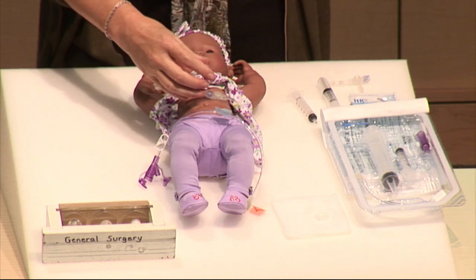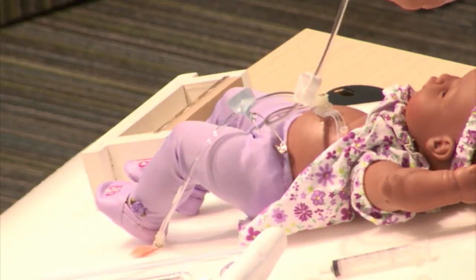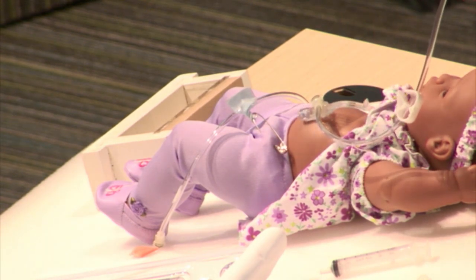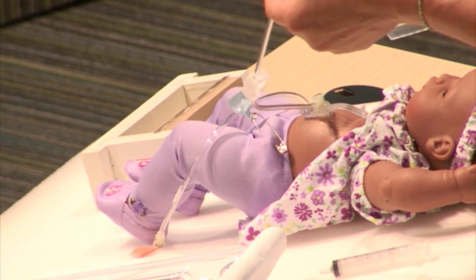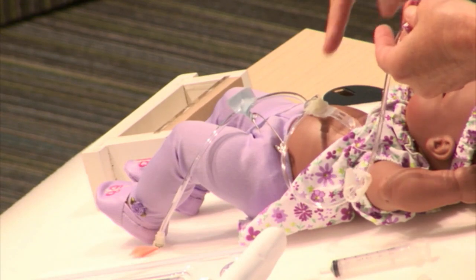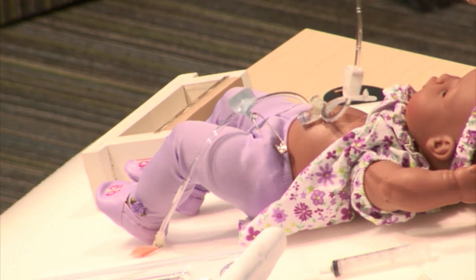Take your syringe or your extension set, line up the black mark to the black mark, push, twist, two-hand technique. I'm going to close my main port here. I'm going to flush some water through here. Now it depends, like most kids, this is not pre-primed, and so this is about 2 or 3 mLs of air here. If somebody's really sensitive to air, you'd probably want to pre-prime your tubing, but most of the time you can just flush it through with water and then aspirate, and you'll get gastric content in your tubing, just like you'd check with any other type of tube, and that's your position checking to make sure it's in the stomach.